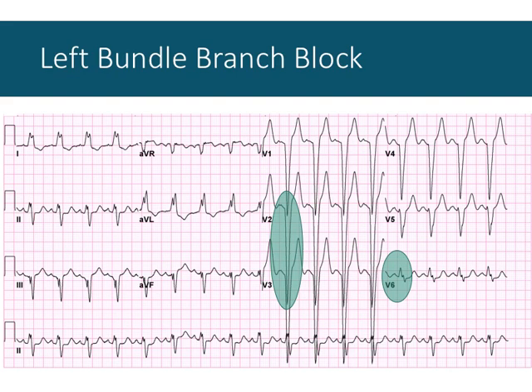We haven't had anyone with a known diagnosis that has confirmed it with the ECG yet. Maybe one of you will be the first, I'm not sure. We haven't found anybody that has an issue, and there hasn't been anything this severe. And we use the automatic diagnosis as a way to practice your interpretation of the arrhythmias. But no, we haven't had anybody fall terribly ill or give us anything interesting yet. So we'll see.